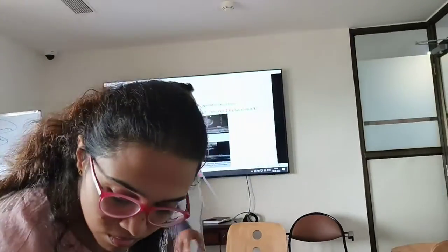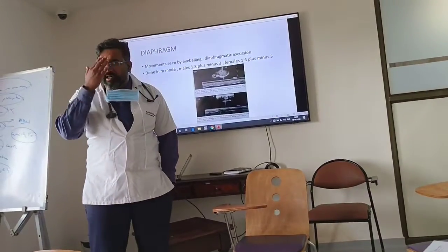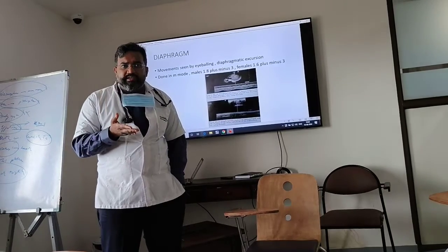Take for example the patient that is lying down there. You have a present patient. Please go and have a look. It's important that you register it in your mind. Your brain will understand what your eyes see.